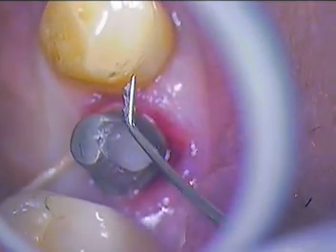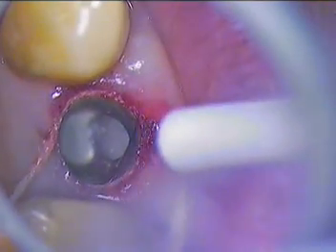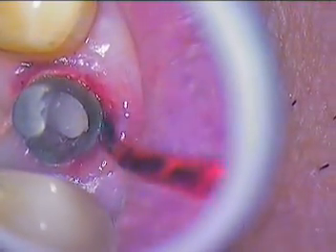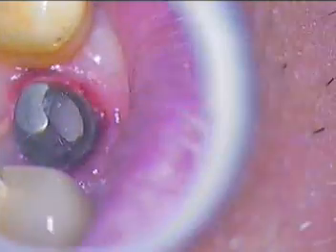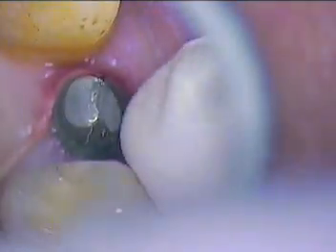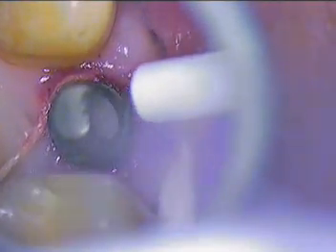Maria, we need the cement and the crown, please. I'm going to go through and just dry that again. I've got a little bit of oozing right now — I want to just control that right in here. So I'm going to add a little astringent, just a tiny bit, and we'll let that sit there. It's just some epithelial tissue, some hemidesmosomes. We're in good shape, ready for our cementing process. I'll just dry and we'll cement. Let me have that suction tip. Light down a little bit.